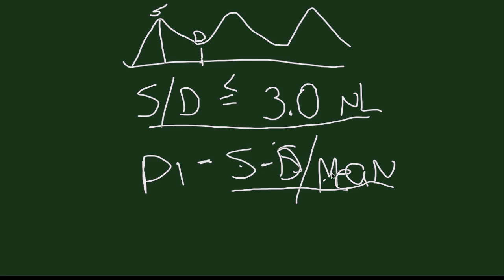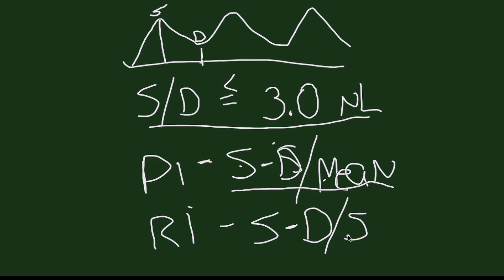There's always systolic flow. The resistivity index is a third calculation, and that's calculated by taking systolic flow minus diastolic flow divided by systolic flow. Now, there are nomograms for each one of these types of calculations based on gestational age. As I mentioned a minute ago, we know that resistance to flow in the placenta should decrease as gestation increases.